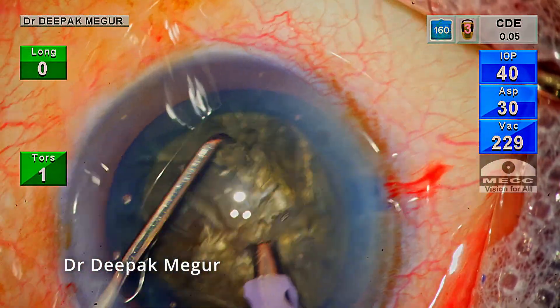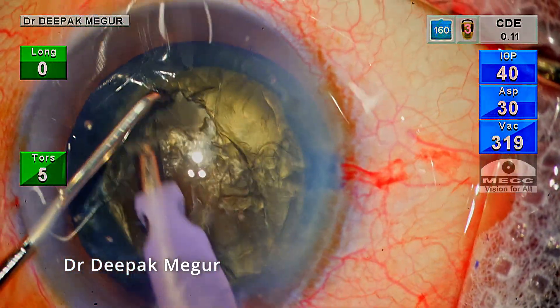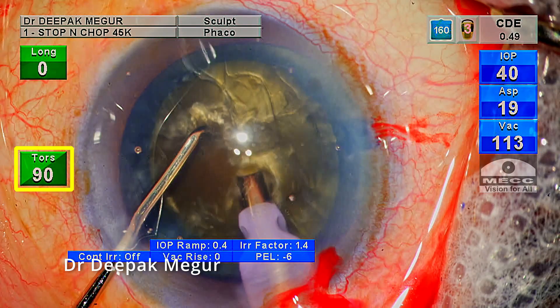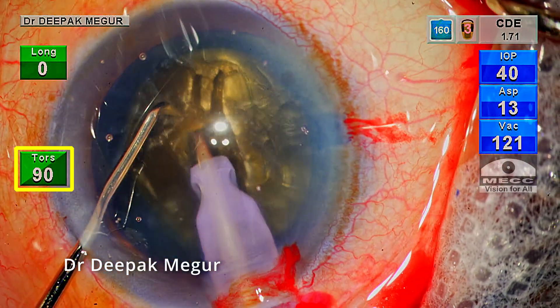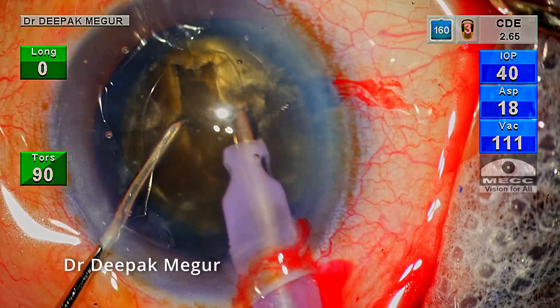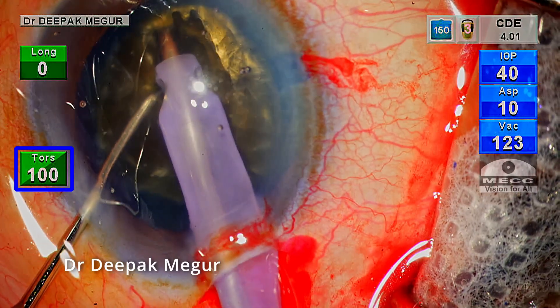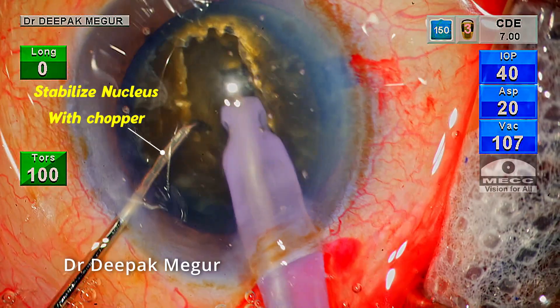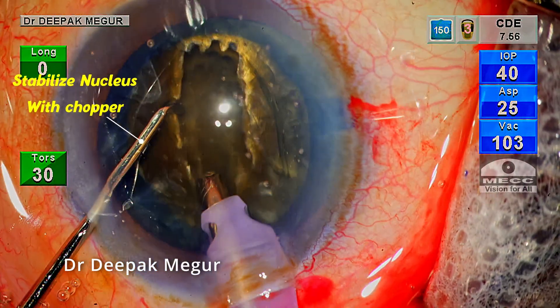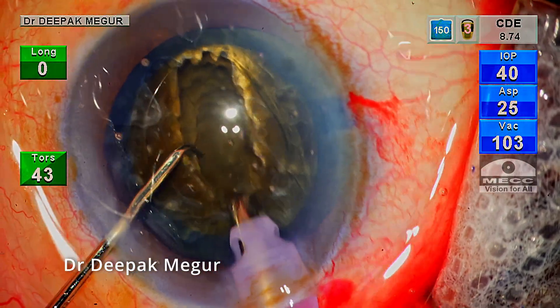Initially, I aspirated a little bit of superficial cortex just to get the flow moving before starting the sculpting process. The plan is to use the classical four-quadrant divide-and-conquer technique, using torsional ultrasound. I begin sculpting using continuous torsional energy in linear mode, increasing my energy settings to 100% as I realize that 90% was not good enough. The nucleus is stabilized with my chopper and the groove is widened so that there is no obstruction to the phaco sleeve as deeper trenching is begun.